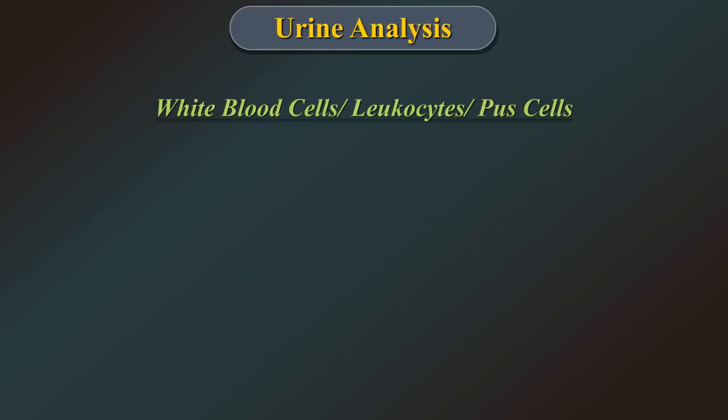Chemical examination. Chemical analysis of urine is important for detection of many diseases.